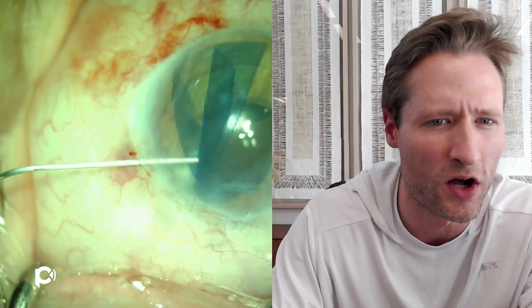The first step always when injecting tissue is to remove the bubble. I'm removing that little air bubble and sweeping the graft out of where it is incarcerated in the primary incision, pushing it up inside the eye. It still looks like it may be kinked, possibly still interacting with the wound, so I'm pushing the graft around a little until I can verify it's no longer stuck inside the main wound. After a few more manipulations, it looks free.